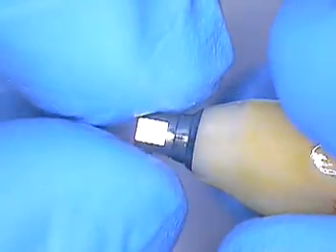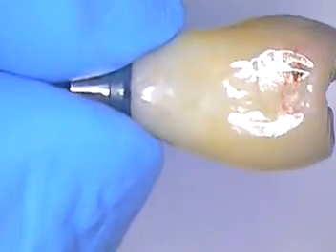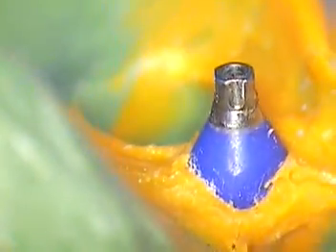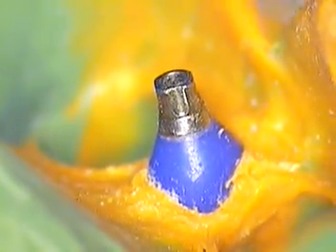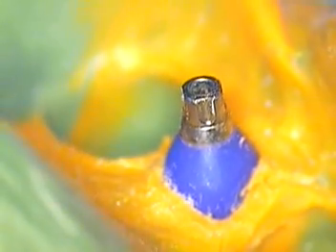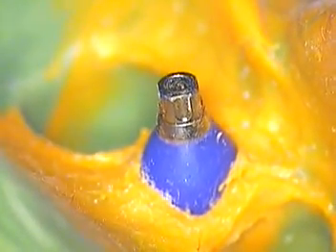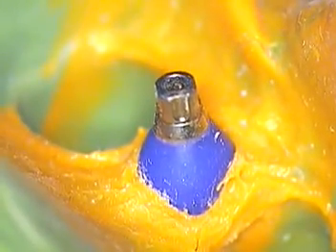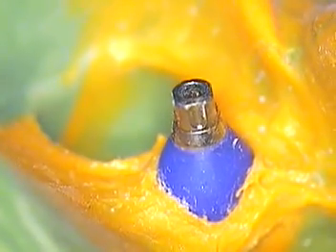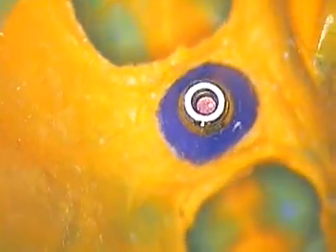What we're trying to figure out is how we can progress from the impression, which has an altered contour as well, mimicking that of the temporary abutment. What I may end up doing is going back and finding the screw-retained metal temporary abutments, expanding on that and copying that, then using that for my transfer copings.